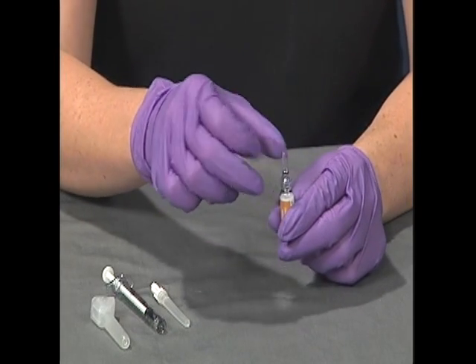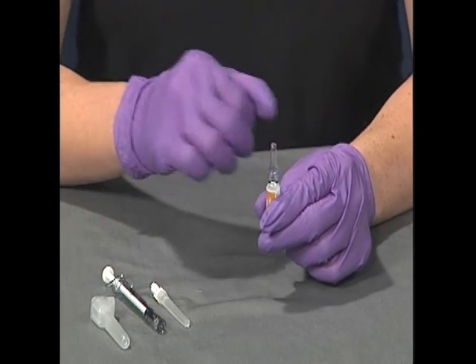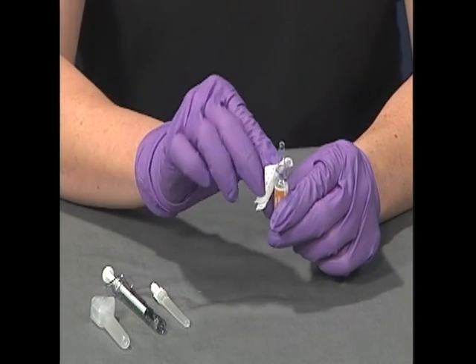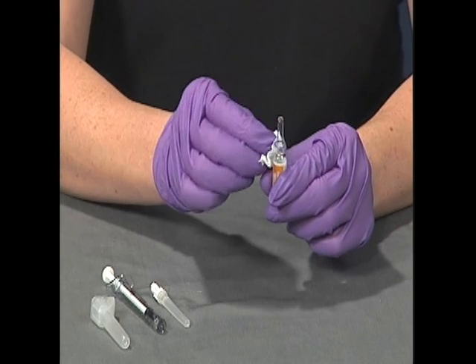Hold the ampule upright and gently flick it to move any medication trapped in the head of the ampule to the base. Wipe the areas between the head and the base of the ampule with an alcohol prep or other suitable antiseptic swab.